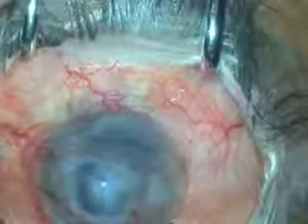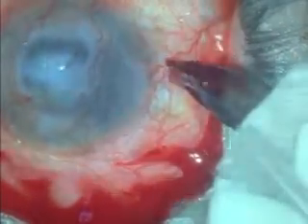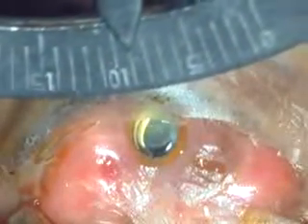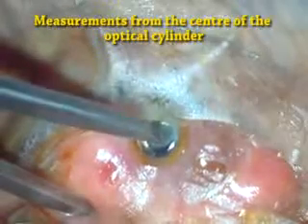zonular vitreous base. In cases where there is corneal opacification but a preserved limbus, standard sclerotomies are made, whereas in cases such as keratoprosthesis, approximate measurements are taken from the center of the optical cylinder for sclerotomy placement.